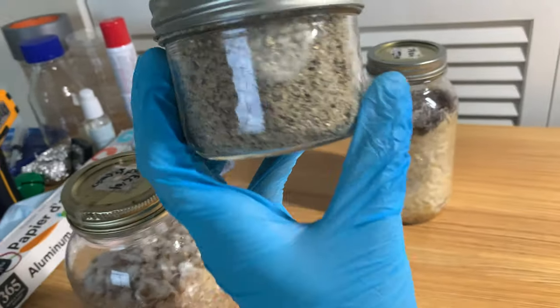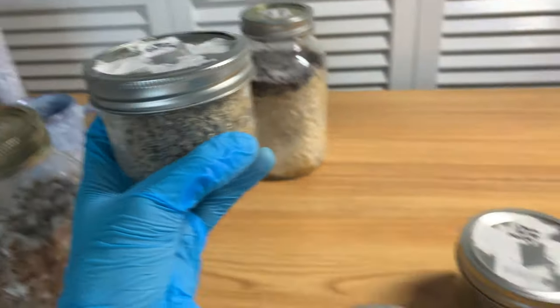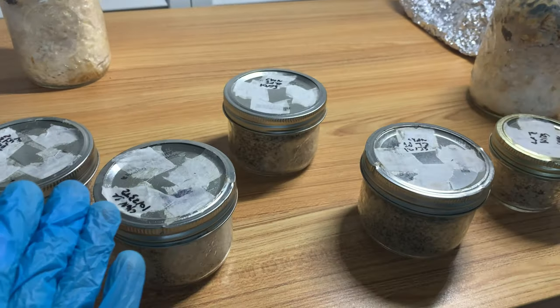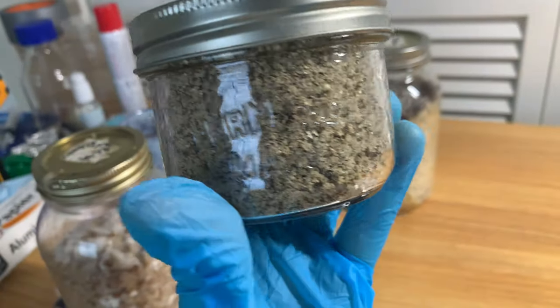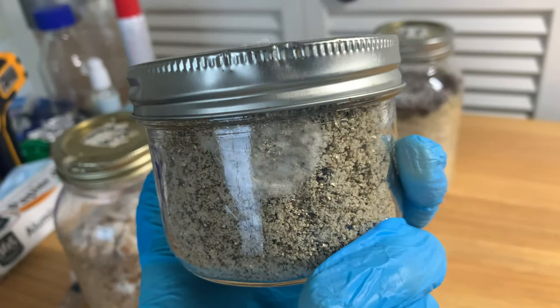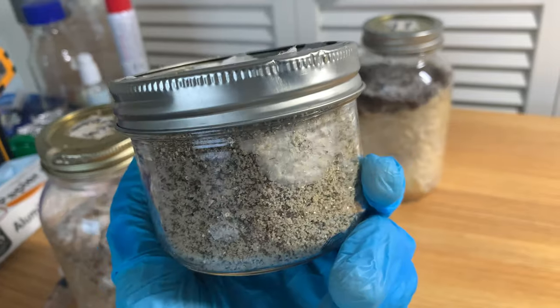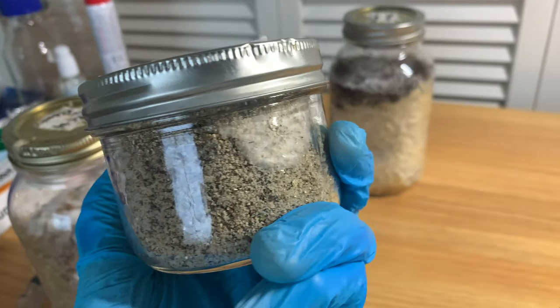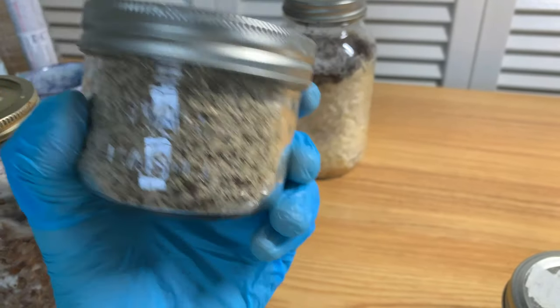Did it work or did it not? It did work. Did it work as well as I thought it would? Not really. But it worked enough. I want to show you guys how these jars did. As you can see, we got some mycelium - though some points have absolutely no mycelium. I was very generous - a whole syringe was put into these jars. Now if I was doing a spore syringe, I wouldn't put that much, but I put a lot because I wanted to see if we could get some fast colonization times. I've had much faster growth from fresh spore syringes - growth in literally two days.